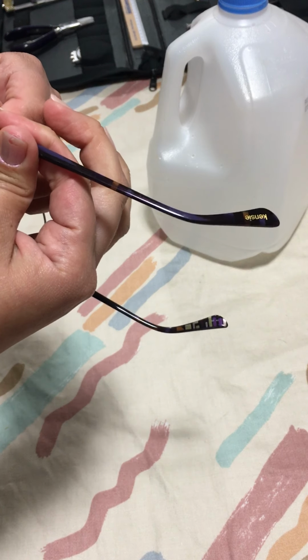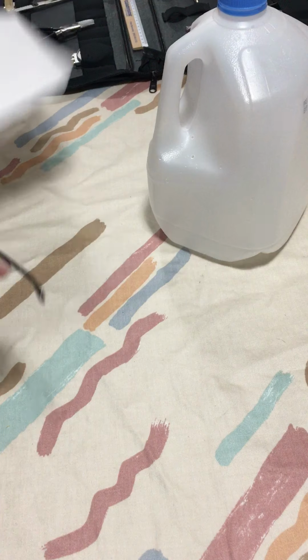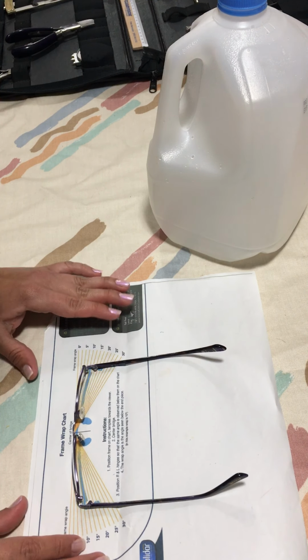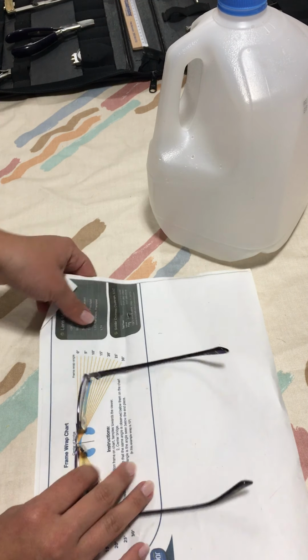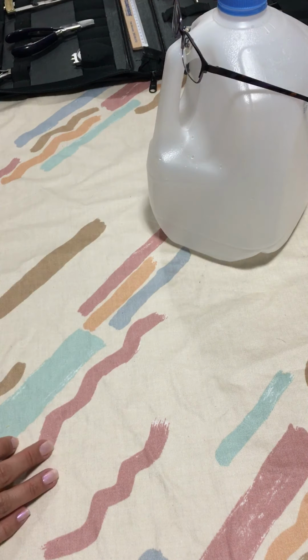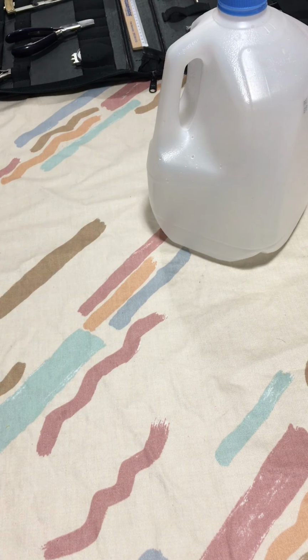Okay. So it still does have pantoscopic tilt, as we can see. It still has pantoscopic tilt. It has approximately, if I put the center right here on my paper, around 10 degrees of pantoscopic tilt. So it's good. Now I put it on the patient's face, and it looks a lot better than it did before. That is how to check for pantoscopic tilt.